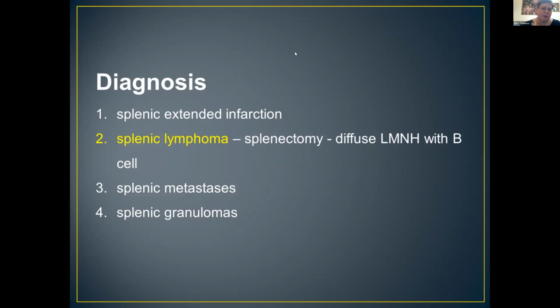So there were multiple lesions with washout. We repeated the CT scan, and the lesions were not actually visible on CT. And I wanted to ask you if you experienced such a situation where the contrast was the only method that showed that there are some lesions over there.